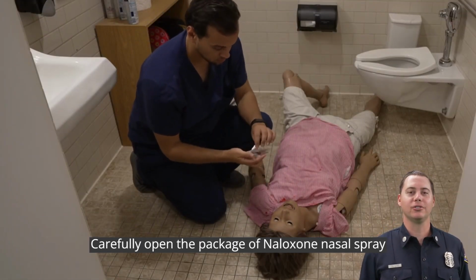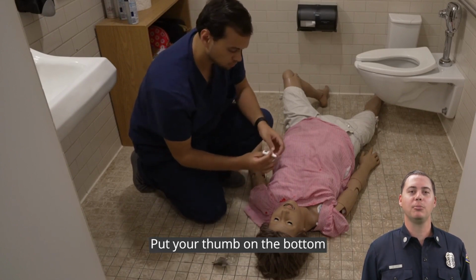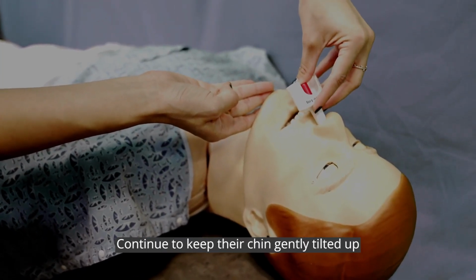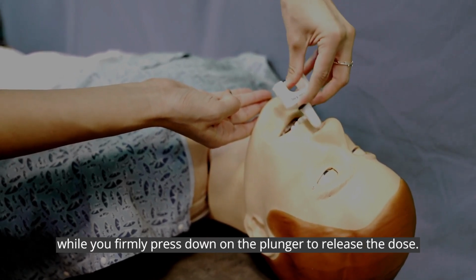Carefully open the package of naloxone nasal spray and review the instruction card. Put your thumb on the bottom and your first and middle fingers on either side of the nozzle. Gently insert the nozzle into one nostril. Continue to keep their chin gently tilted up while you firmly press down on the plunger to release the dose.